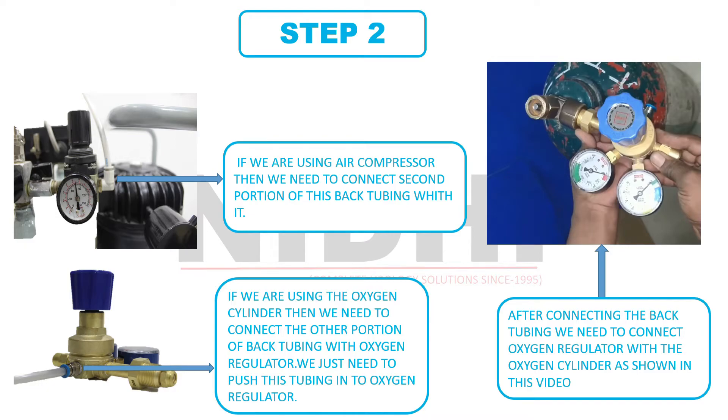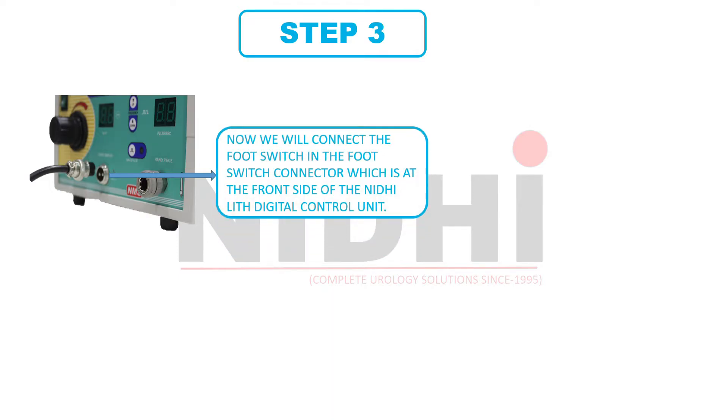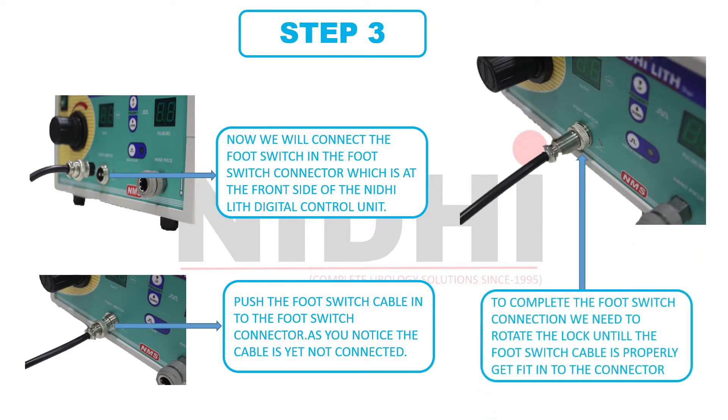I hope you have completed this connection successfully. Now let's move towards step 3. At this stage, we will connect the footswitch into the footswitch connector, which is at the front side of the NeedyLit Digital Control Unit. This is the footswitch connector and this is the handpiece connector. We push the footswitch cable into the footswitch connector. As we can observe in this image, the footswitch connector is not locked properly. By rotating this lock, we can complete the connection of the footswitch with the control unit. This image shows the perfect connection of footswitch and control unit.